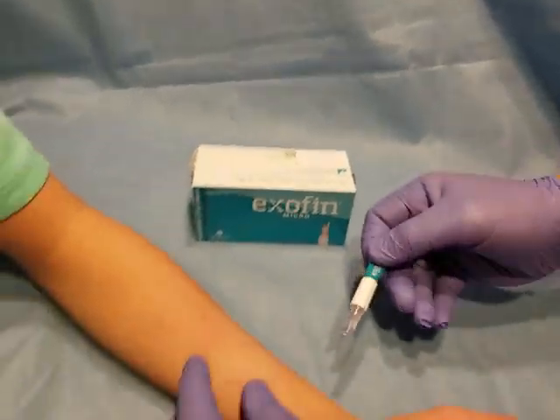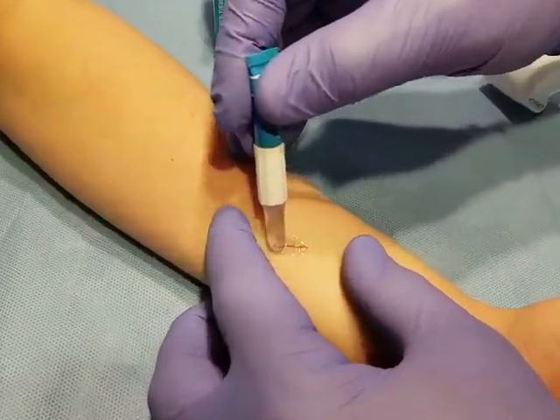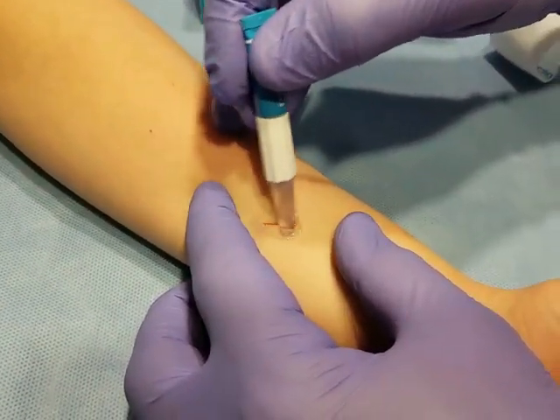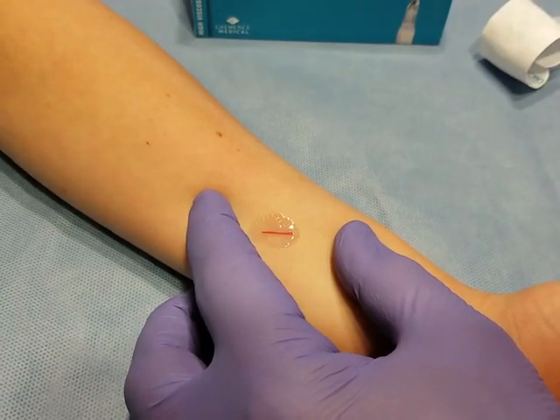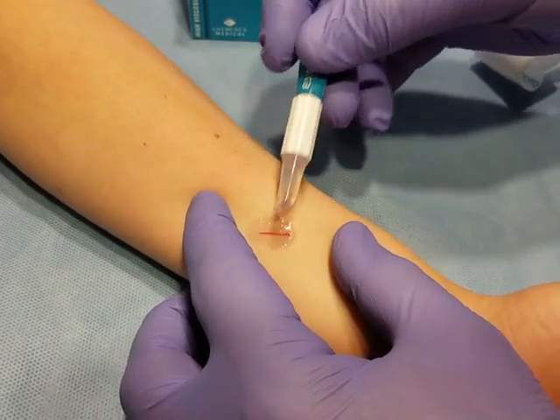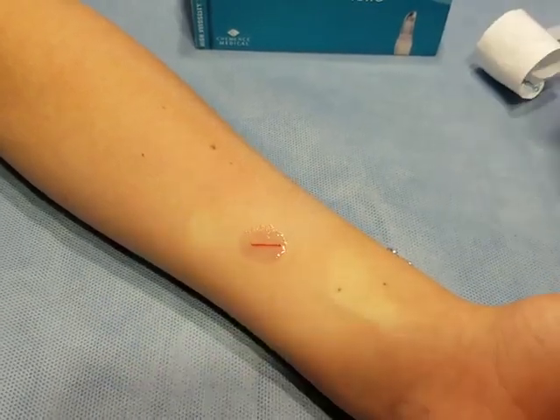Once you see that, you're going to go down and pull laterally on your incision and apply a light coat of glue. Give that about 10 to 15 seconds to become tacky, and then you can apply another coat of glue over that. Once you've done that, that's it. Thank you.